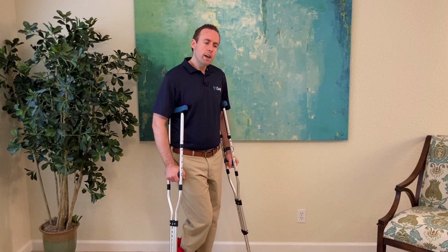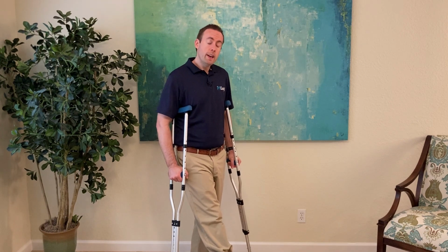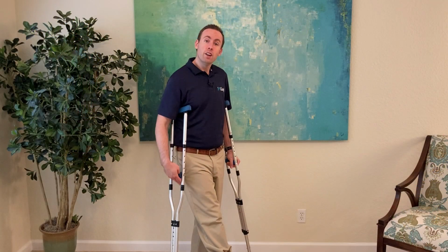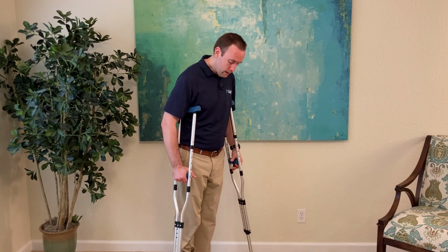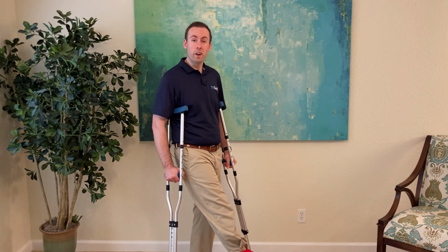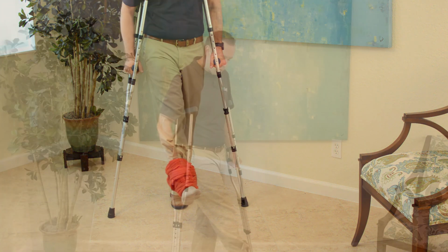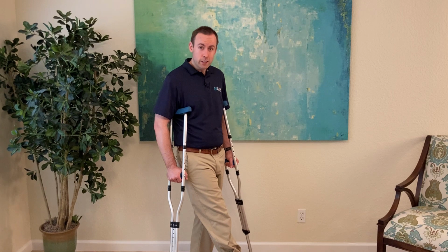You need to make sure that your other leg doesn't get too tired by keeping your leg straight out. Now, if you have a knee injury and you have to keep your knee in extension, straight the whole time, so you can't actually bend your knee, then if you hold it out like this, you're going to get a lot of hip pain when you're trying to maneuver, and it's going to throw off your balance because it's way far away from your center of gravity.